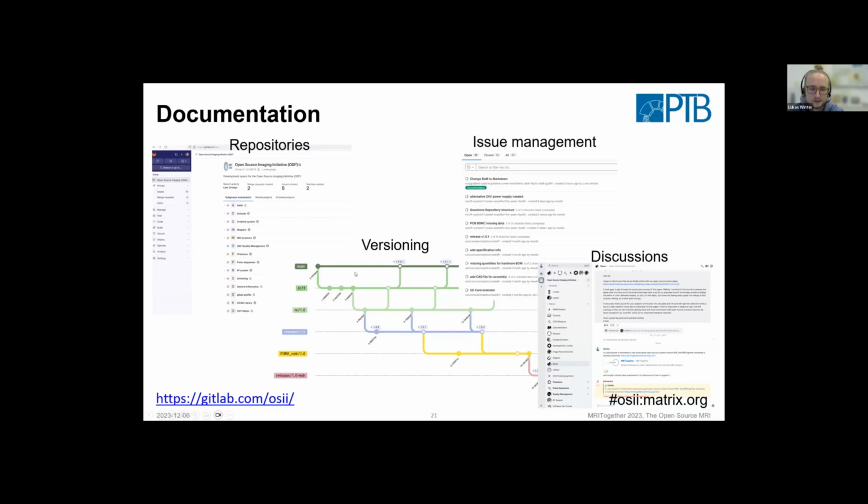Versioning: there's a versioning strategy with which branch to work on, and then you have a release at a certain version. At some point, and this is this yellow branch here, if the release is mature enough, then this will be forked into this documentation pathway of something that goes more towards regulatory approval. And this will then be fixed. So this will not be touched anymore.